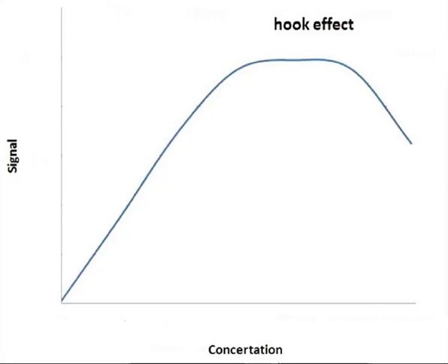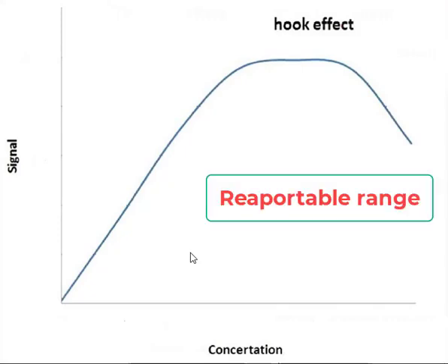Okay, back to our main topic. Hook effect. I want to talk about the hook effect. Hook effect gives falsely low results as a consequence of high concentration of analyte in the sample. When the amount of analyte is low, by low I mean it is within the reportable range of the assay.